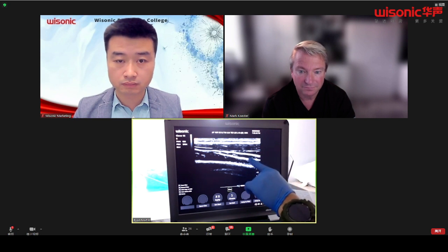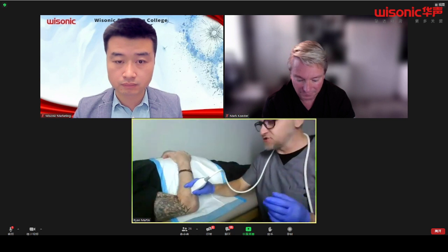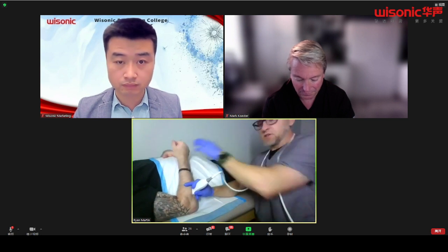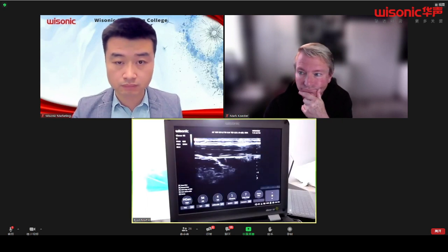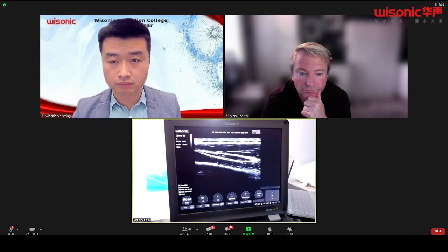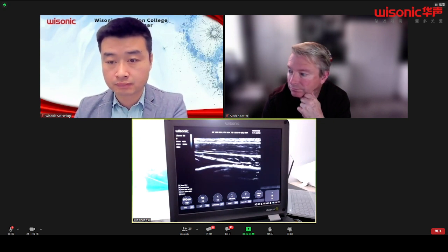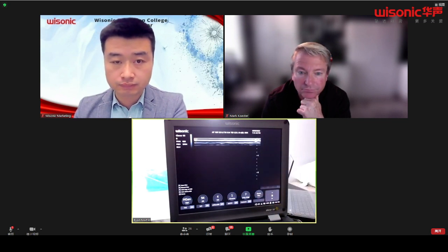Again, sensory versus motor. Well, if you suspect any type of entrapment there, all you have to do is find that area, and then you can have them supinate and pronate. And I'm going to show you what that looks like on the screen here. Can you slowly pronate and supinate? And what you'll see is those two supinator heads contract with that nerve right in between. So if there's any entrapment there, one, you'll probably get a positive test and they'll feel that. And two, you'll see the nerve compress right through this area here. And that would be more of your supinator syndrome.